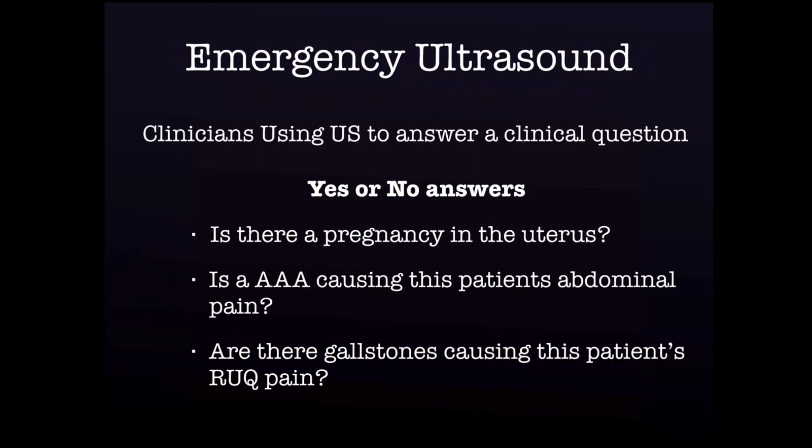So this all started with the concept of emergency ultrasound. Emergency ultrasound was a new technology. It was non-invasive. We could use it on patients right there at their bedside, and this patient was dying. So if I could take the ultrasound transducer, put it on there, and find that life-threatening condition, I could treat it right at bedside. That patient should have a better outcome than if I waited for a radiologist or did some other test and the results were delayed by minutes or hours.